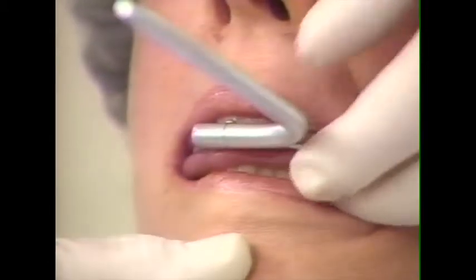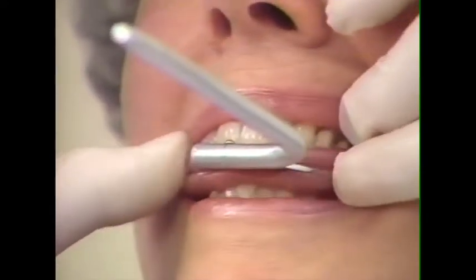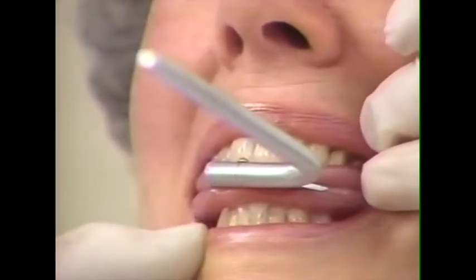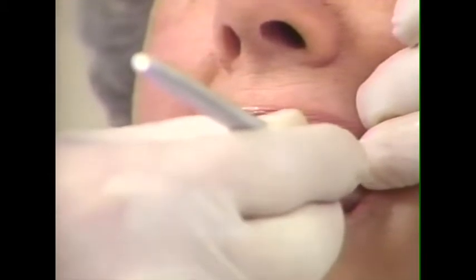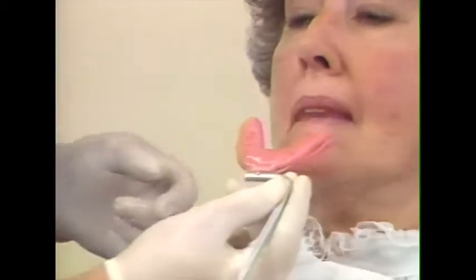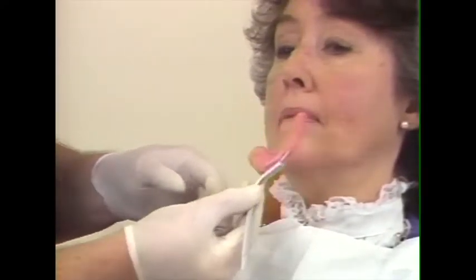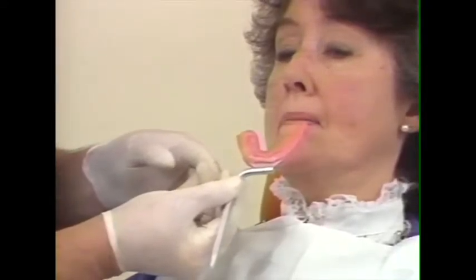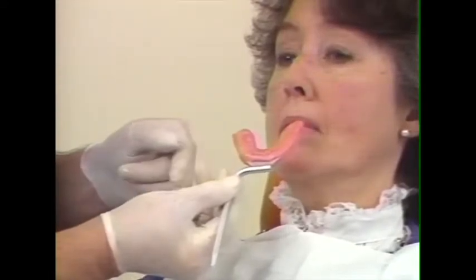Hold it right there. It is not necessary to secure a centric relation record at this time. We let this cool for a moment, remove it, and inspect our record. Here we have good indentations of the maxillary teeth, and the mandibular teeth have not penetrated through the wax, so that the record could be distorted if it had been penetrated.